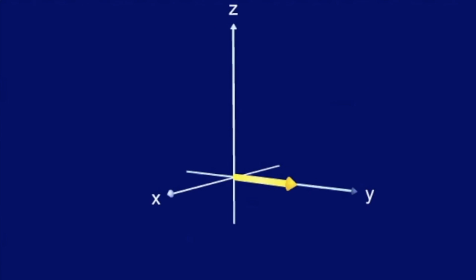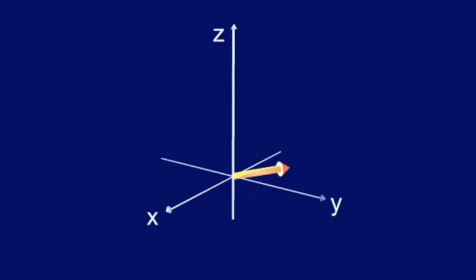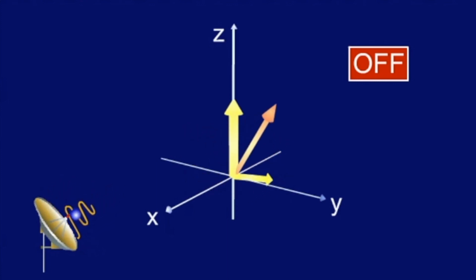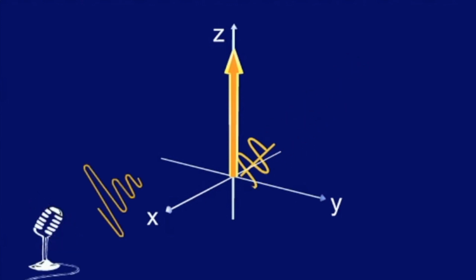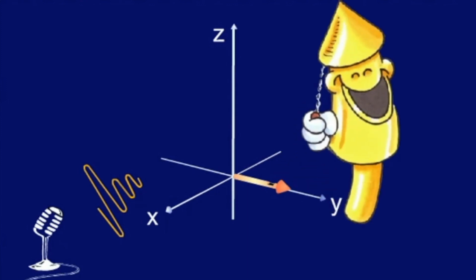I hope that you recall that a changing magnetic force, moment, can induce an electric current, which is the signal that we receive and use in MR. So if we put up an antenna somewhere in our last example, we will get a signal like this one. This is easy to imagine if you think of the antenna as a microphone, and the sum magnetic vector as having some kind of a sound-emitting device like a steam pipe at its tip.